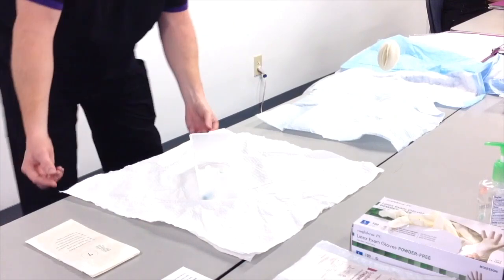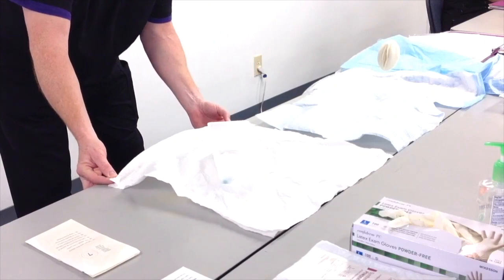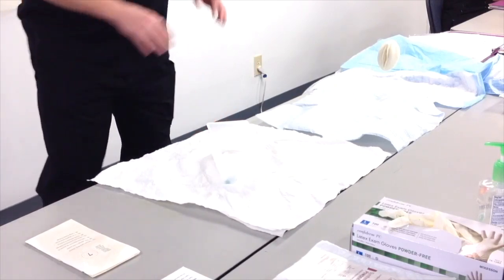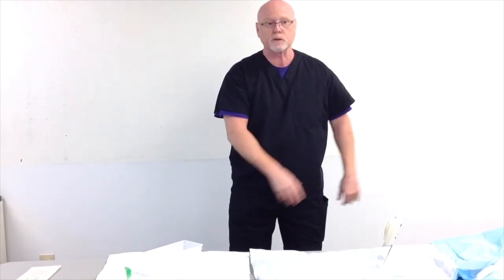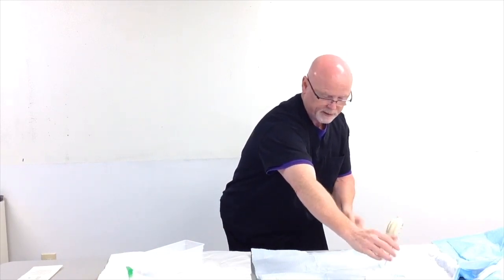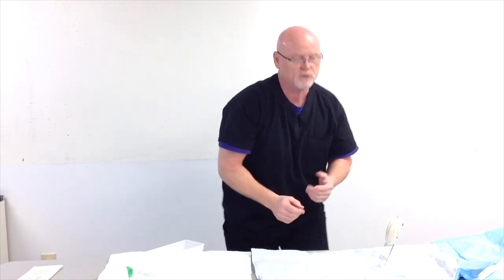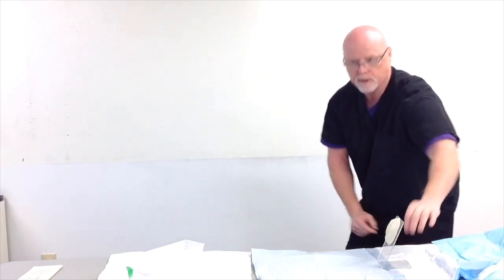Okay, now I could slide this down until it touches or comes close to touching right here. Now I've established my sterile field. You'll notice that I did not drape my patient like this. If I'm holding the corner of this drape, is my arm not reaching over that sterile field? Did I not break the sterility of that field? That's why you drape like this, as opposed to reaching over like this.